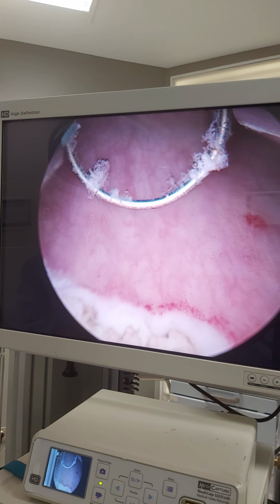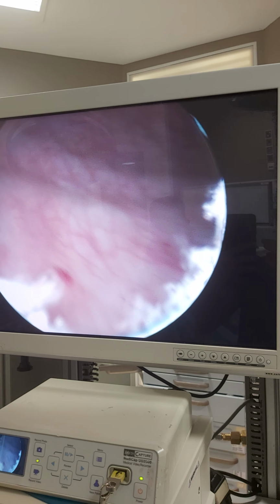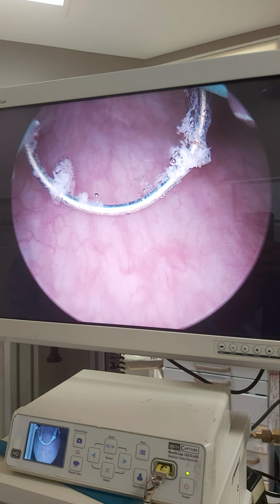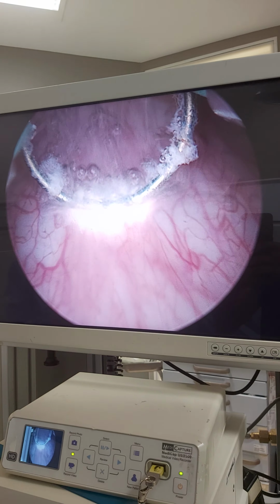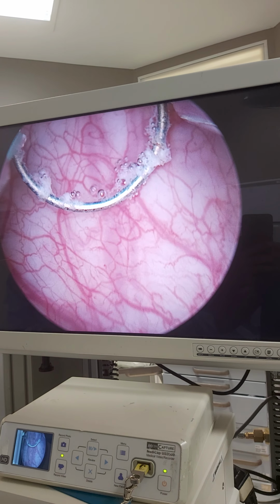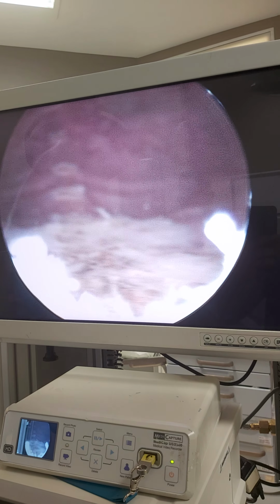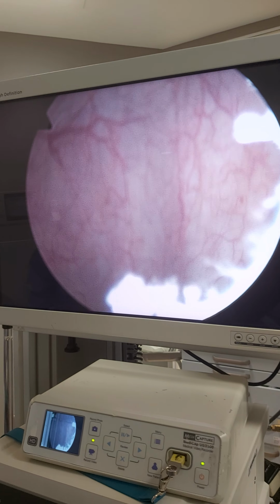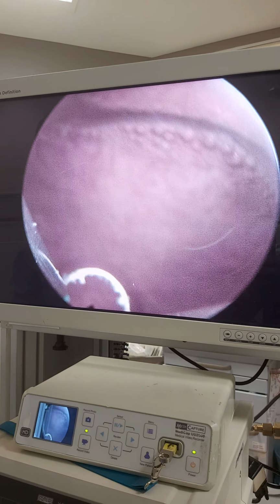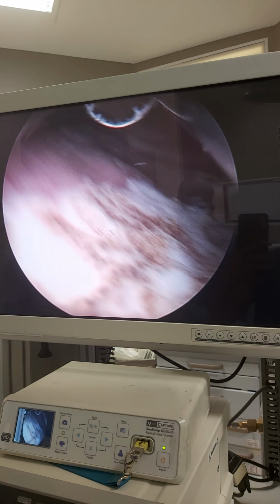Look at this tissue; it's little inflamed. It's not like here. Look at this part, different, this part different. So here I do some spots of fulguration, and I let some tissue healing. Look at the abnormal vasculature. So these spots, other than that, the bladder walls all seem normal. There is no bleeding, no fragility in the bladder wall. So I hope a real good recovery for this patient.